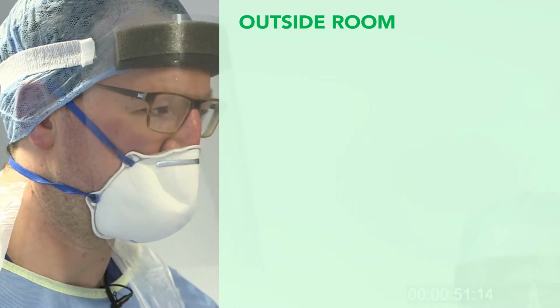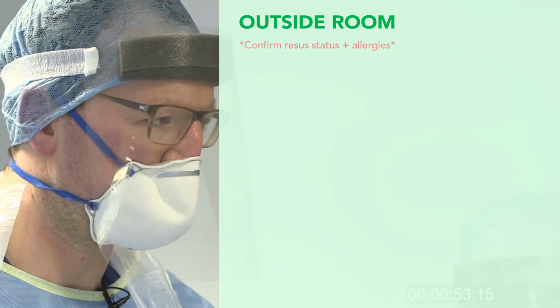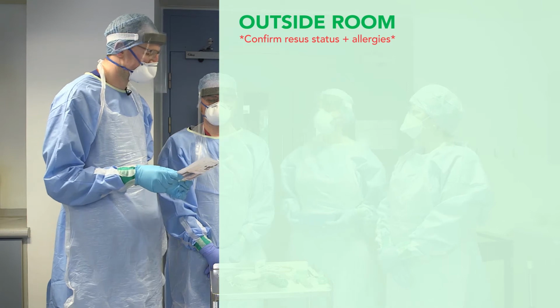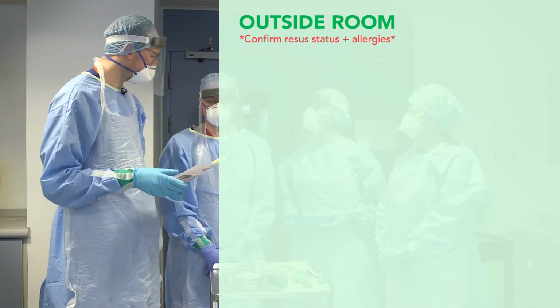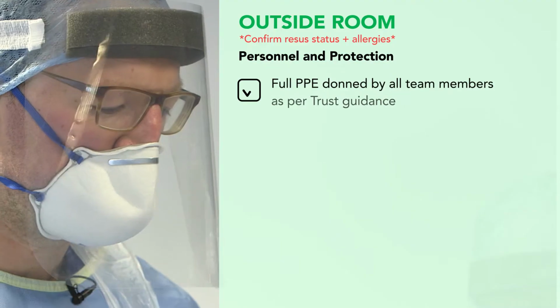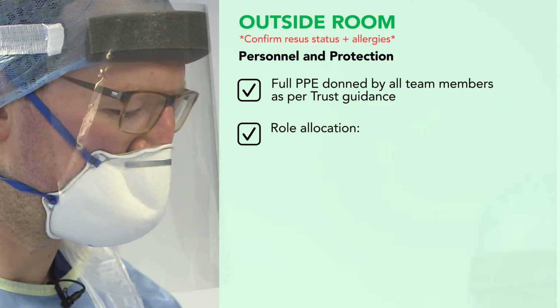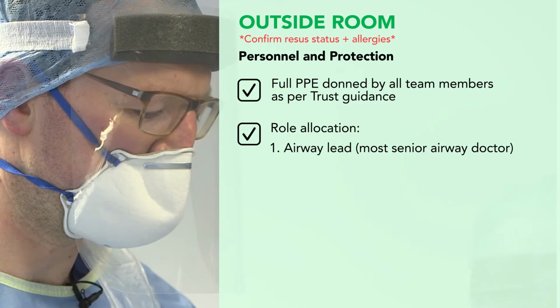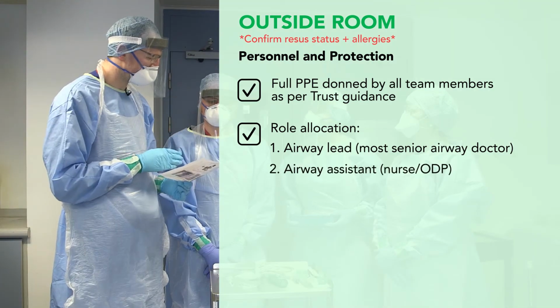COVID-19 tracheal intubation checklist. I'm going to start off by confirming the resus status of the patient. The patient's for resus. And Trevor, does the patient have any allergies? No allergies. So we're going to start by allocating roles in the team. So I'm going to be the airway lead, the most senior airway doctor. Trevor, if you're happy being the airway assistant.